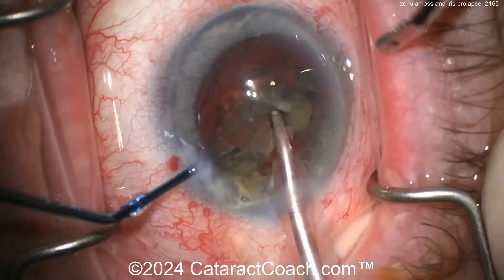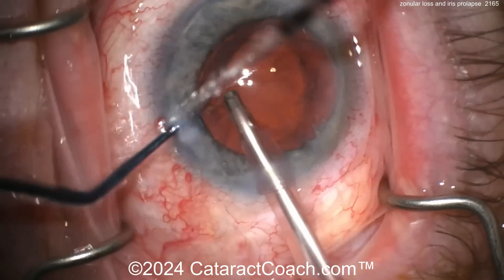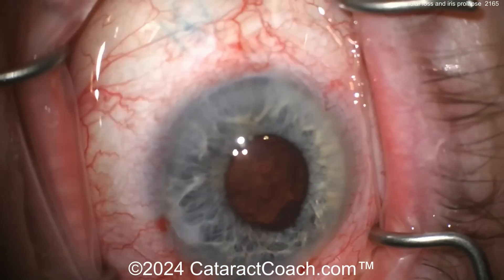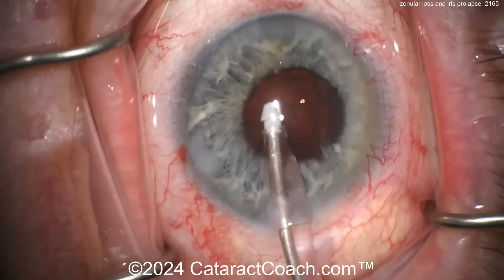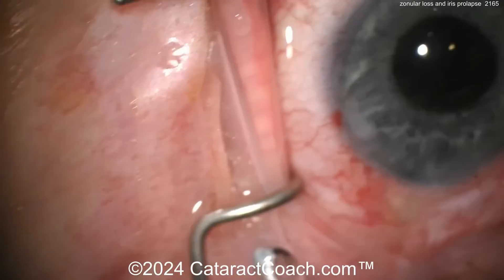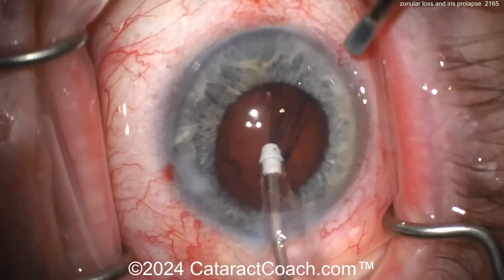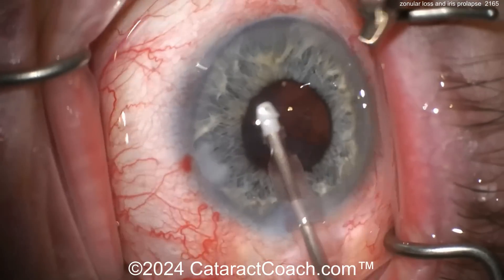Now wolfing down the cataract pretty easily — that goes down very nice and simple. Let's slow it down now when we get to the tough parts. Here we go. Now look at the pupil — oh, what happened? It's come way down. Look at that. So at this point you put in some iris hooks. It's kind of tough to put a pupil ring — do you just power through here?